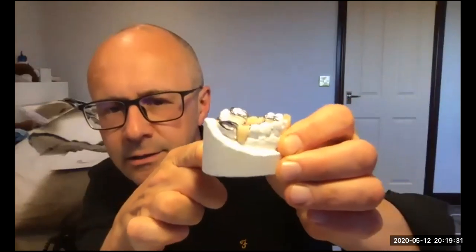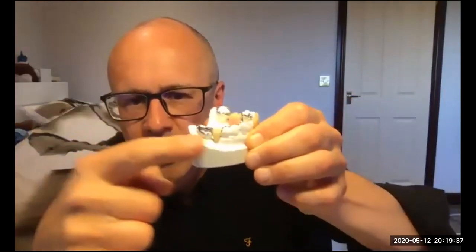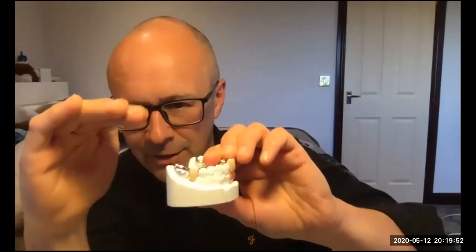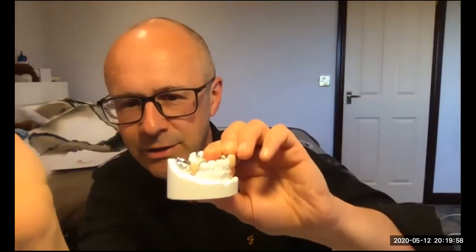Can you see that? That's a ring rest on a denture there with a clasp that comes down in chrome and engages the undercut there. So it's got two parts. The rest part is the ring on the top, and the ring itself adds support, and then this clasp arm comes down and engages the mesial of that tooth to retain it. So it's helping with support and stability with the rest, and retention with the clasp.